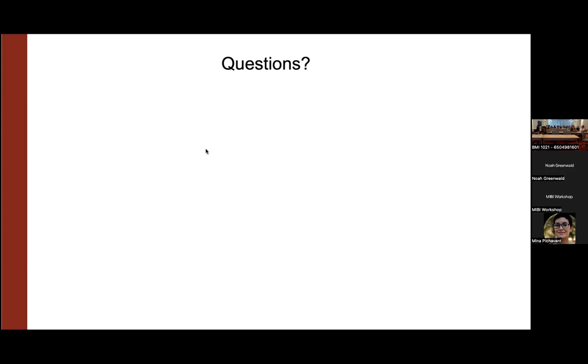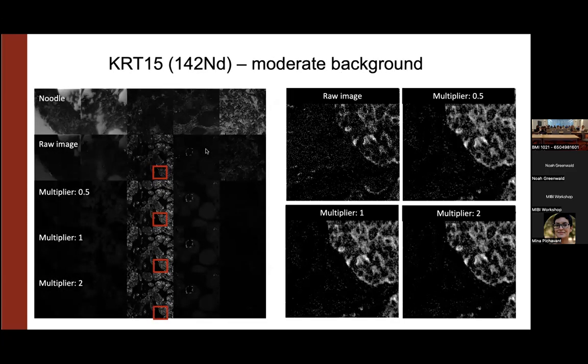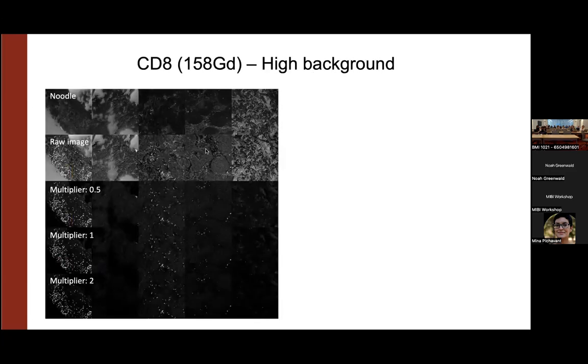My main question is, when you're doing the noodle adjustment, you're showing us tissue stained by antibodies. You're not going to use it all at once, you'll go through each tissue type and edit it accordingly, or you'll run the whole thing and then go back? Right, so I think what you're saying is, do you change the coefficients per FOV? No, so what we do is the matrix will be applied to your entire cohort.